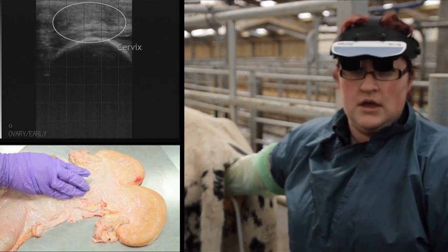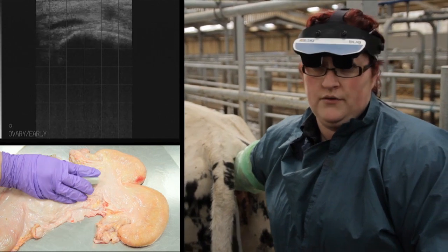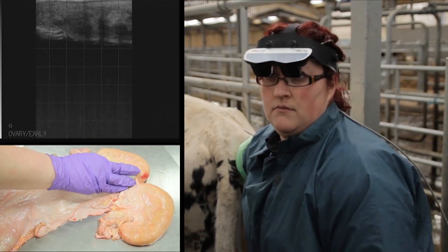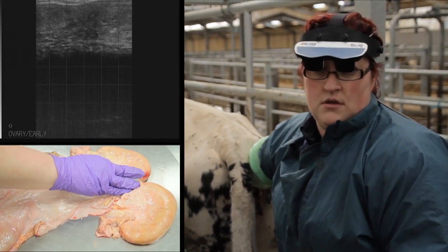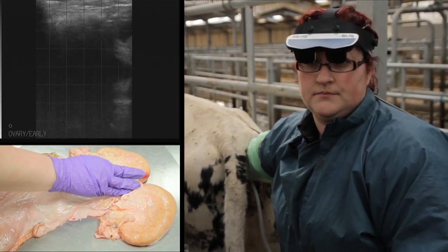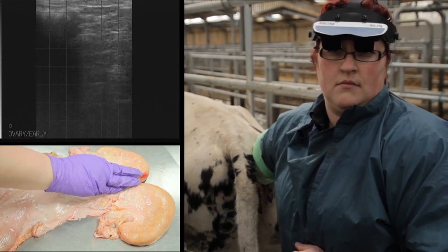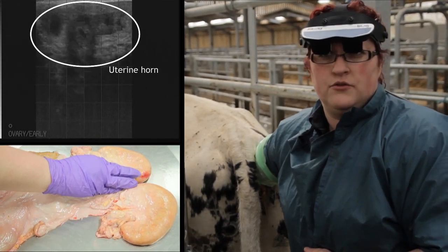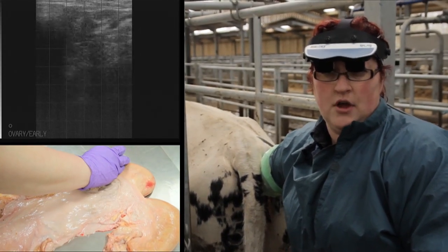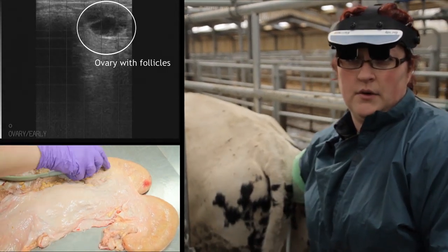What we'll do now is locate the cervix again, move slightly cranially or forward within the cow, always keeping good contact. Then what we can do is travel up one horn, up to the ovary, and we can rock side to side to evaluate the ovarian structures.